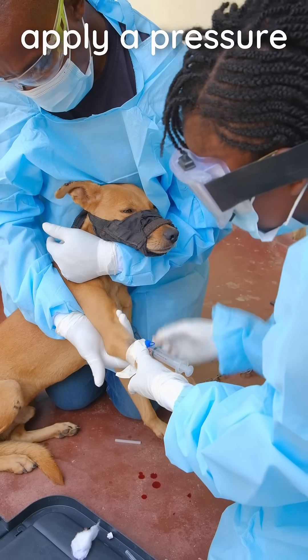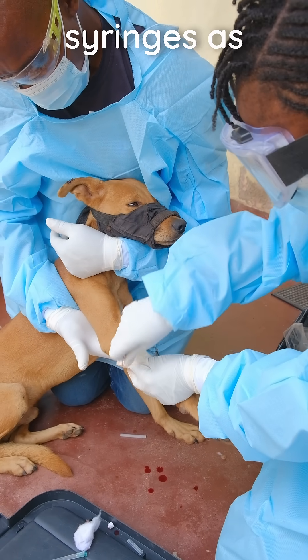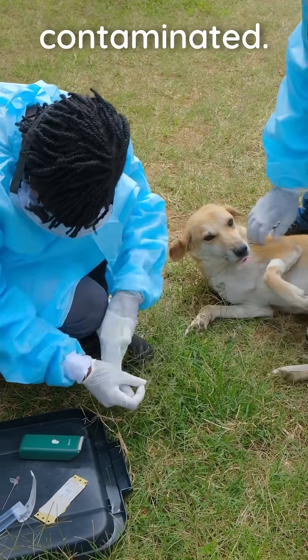Carefully remove the catheter, apply a pressure bandage and check for extravasation. Immediately discard the catheter and syringes as well as all PPE that may be contaminated.